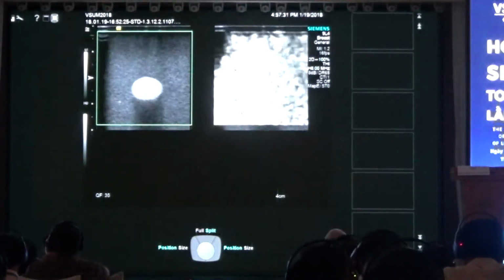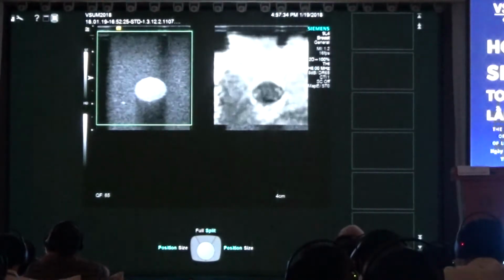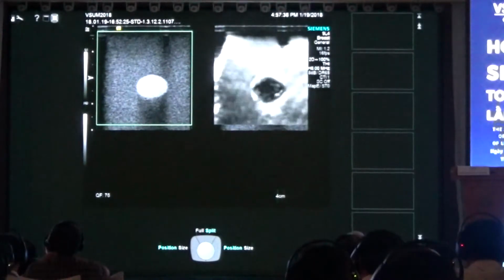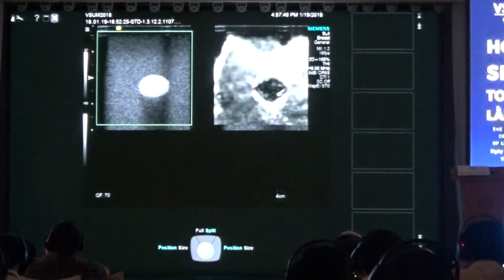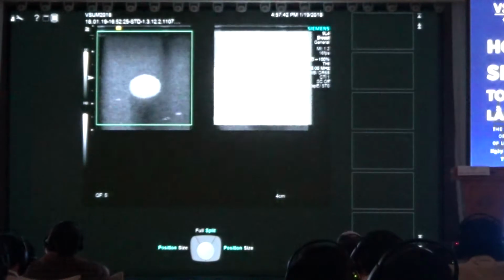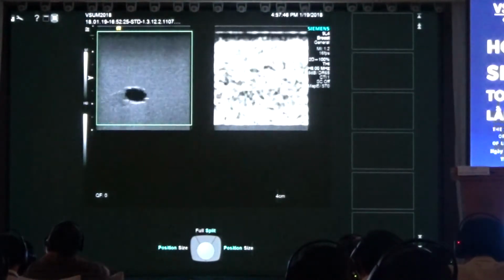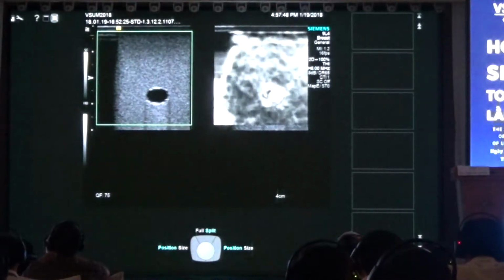So again, I think the important point here is you can see that by doing things wrong, I can get any value you want from a value. So you have to be very uniform in technique and have very good technique to get consistent results. Let's see if we can.